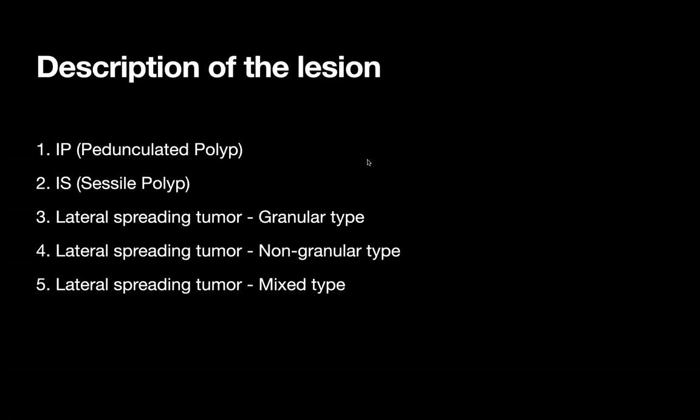And when you have a pedunculated polyp, it's much easier to resect because the pedicle is not difficult to resect compared to resecting a large area of sessile polyp. So something to keep in mind.